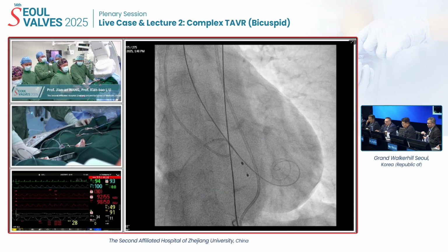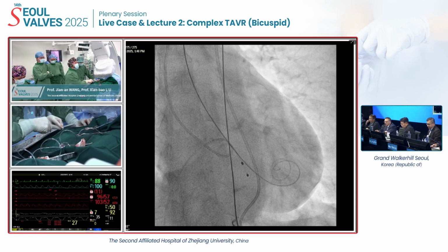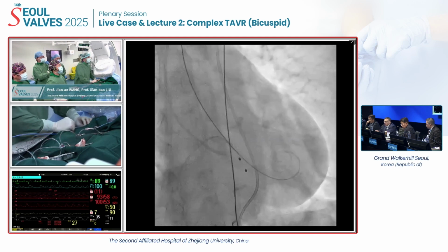I mean, well, we'll see how you do it, but I'm becoming increasingly convinced that we should pre-dilate, and then take a look with the contrast injection to see how the balloon seals. And so I guess I would use a nominal size balloon here.